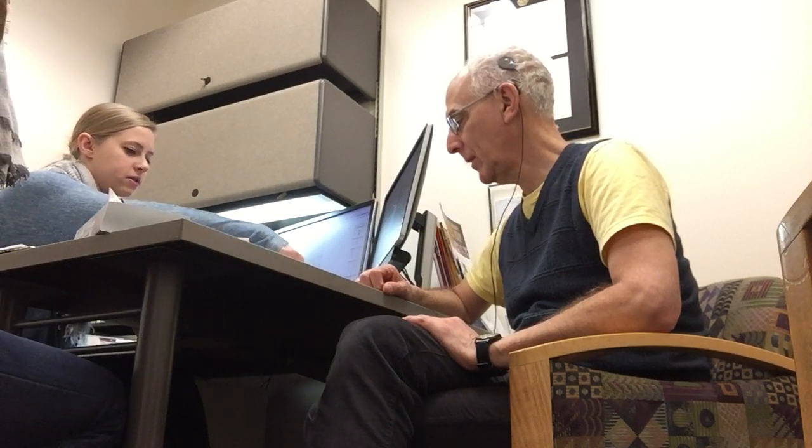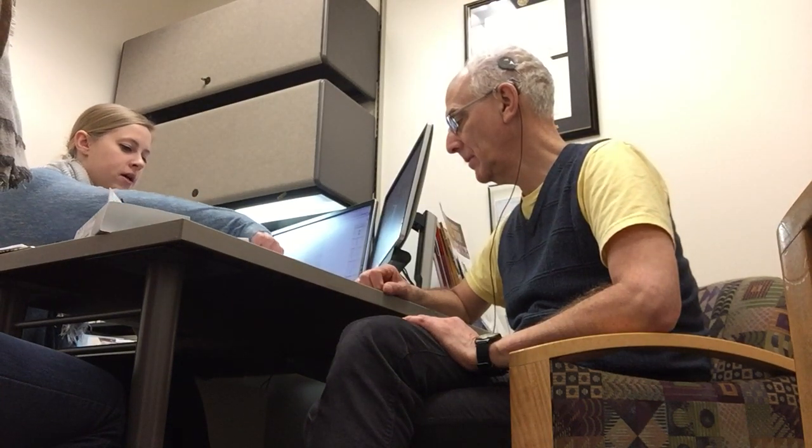So now you're gonna hear some louder sounds. Do I have to read something? A little bit. Okay. So I don't want you to count the beeps anymore. I'd like for you to tell me kind of how loud they are. Down here is you just barely hear it. Then we get up here to kind of comfortable sounds, and then we kind of want to be right here, most comfortable. Okay, and so we want to kind of push it. We want it to be loud but comfortable.